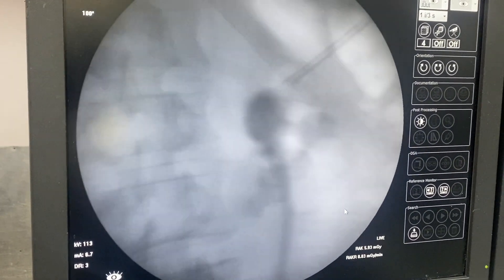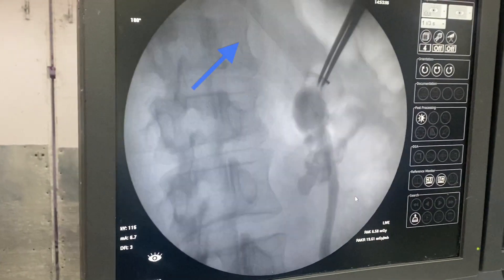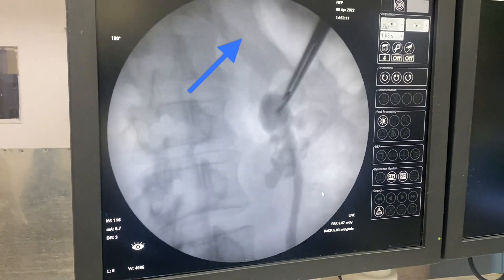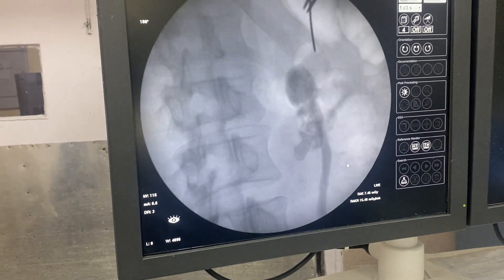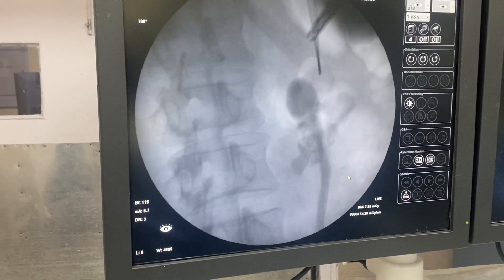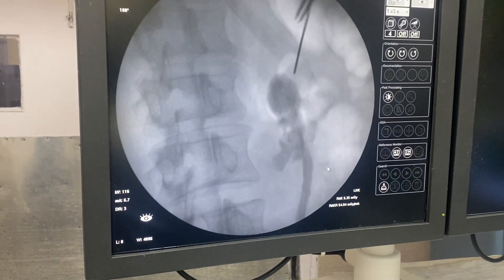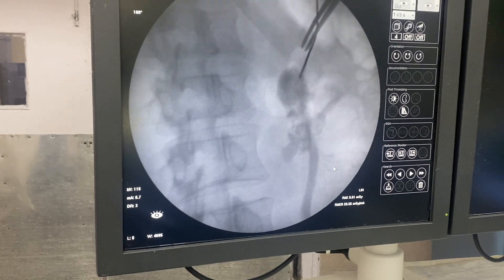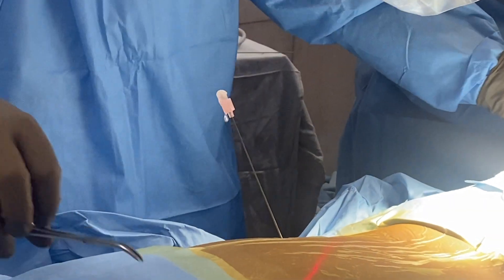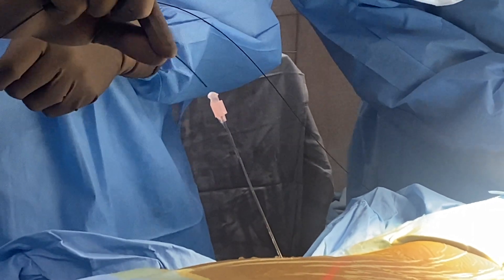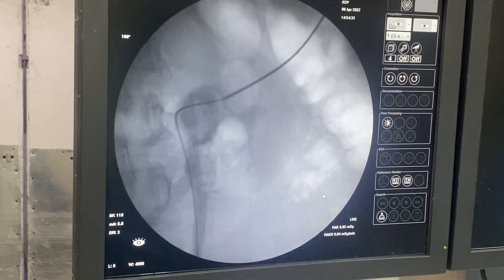When the C-arm is rotated from 0 to 30 degrees, you can see the calyx coming medially. The overlying rib was in the way, so we changed the skin puncture a little bit higher up. The needle is slowly guided into the center of that calyx at an oblique angle. The needle has entered the calyx and once pressed with an artery forceps, a giveaway sensation confirmed the needle was in the desired calyx. The position is confirmed by free efflux of saline coming out through the puncture needle.